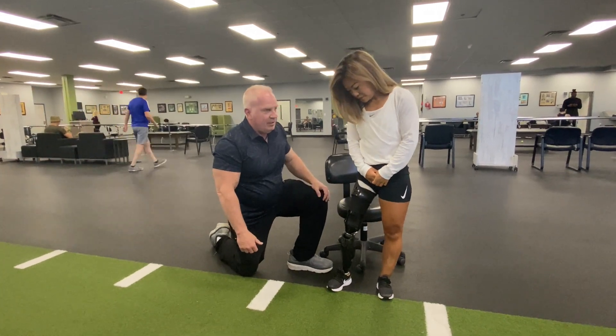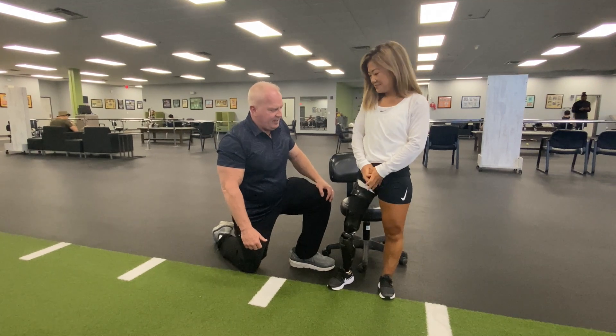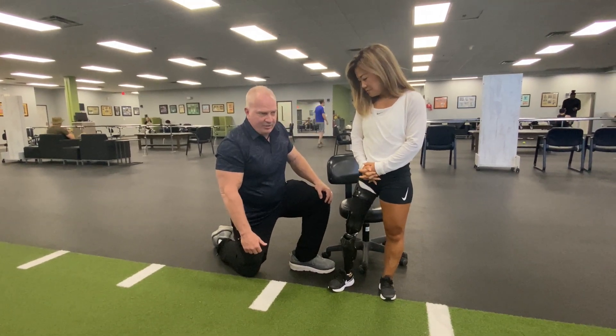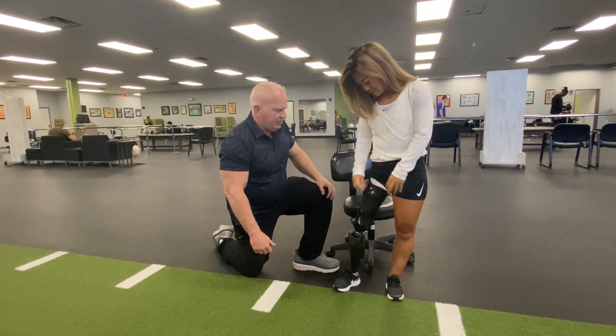Scout is wearing the PPS system. She's a current Paralympic athlete and has the fourth fastest time in the nation right now in the hundred meters. Now she's going to show us how it works — go ahead and Scout, slide that off.